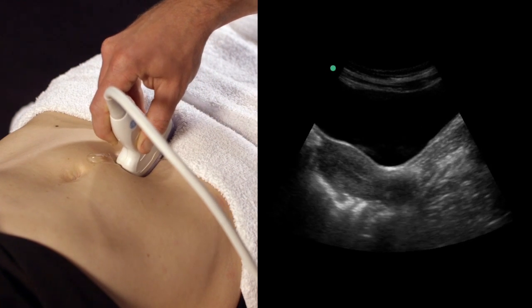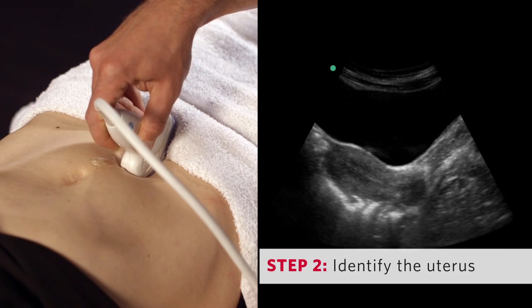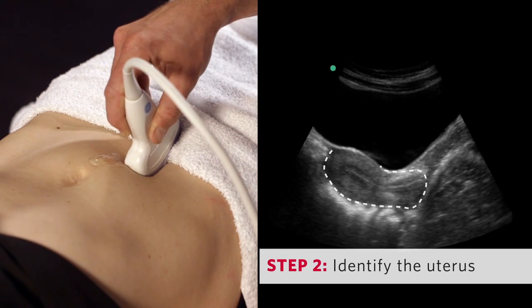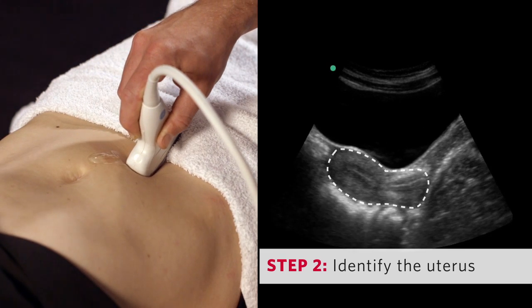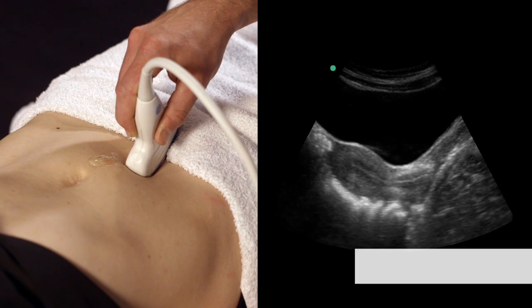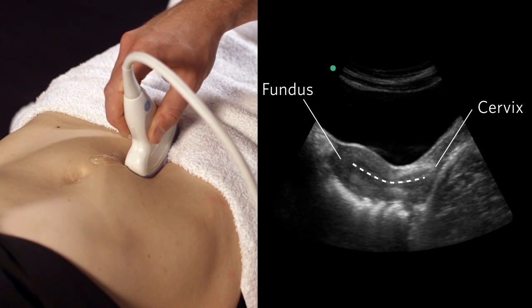Once you've identified the bladder, you can proceed to step two: identifying the uterus. Look for the body of the uterus just posterior to the bladder, along with the endometrial stripe, fundus, and cervix.